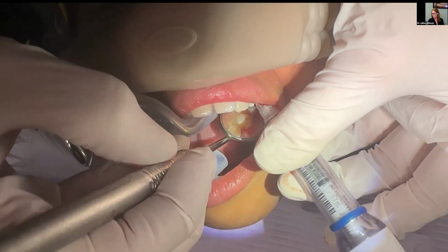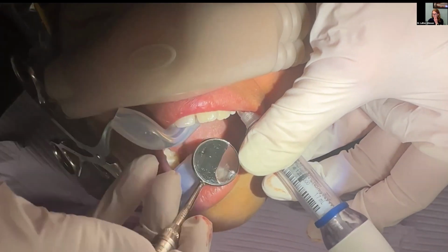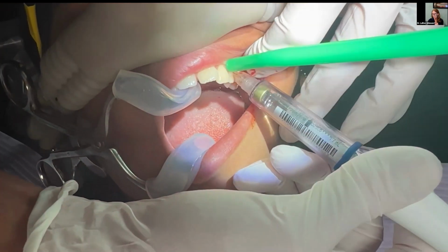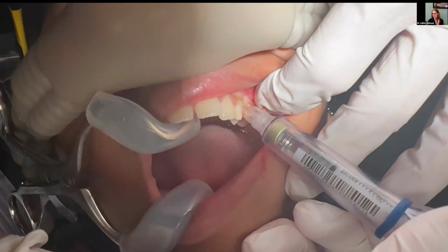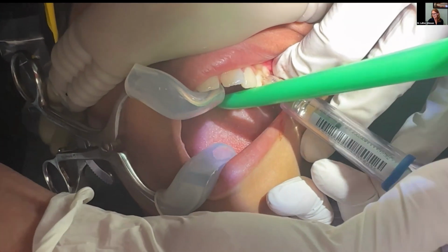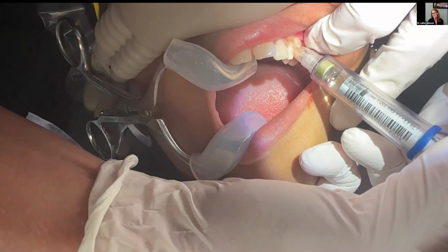One thing I'll let you know, it's a tricky little thing. The canine prominence is a highly corticated place because we know form follows function. The canines are the pillars, the cornerstones of our mouth. They are our interference teeth, how we guide things, and the bone responds in strength. So don't let canines fool you, even little primary canines. They can be very, very tricky to pop through.